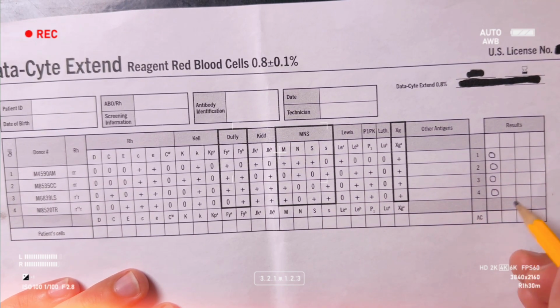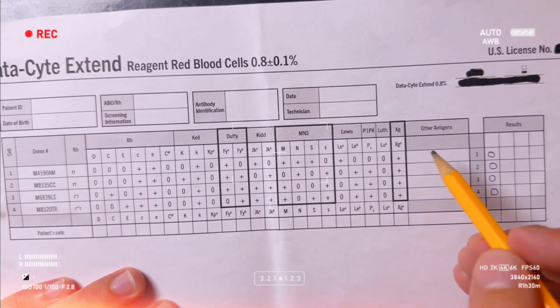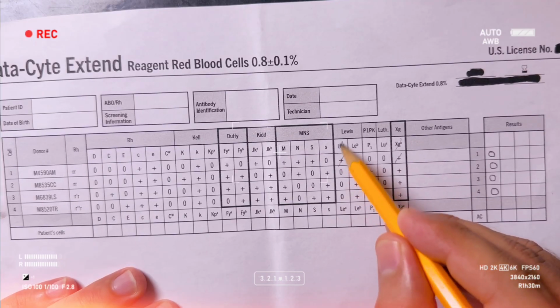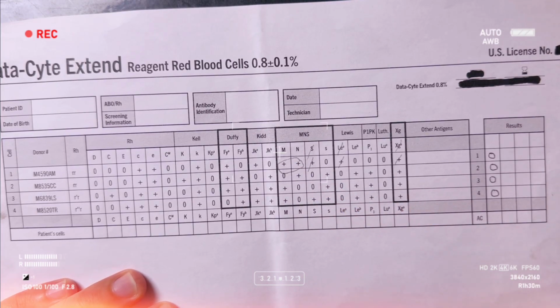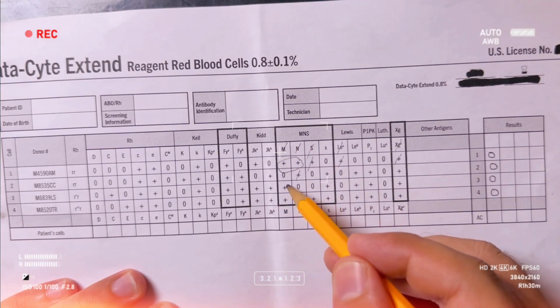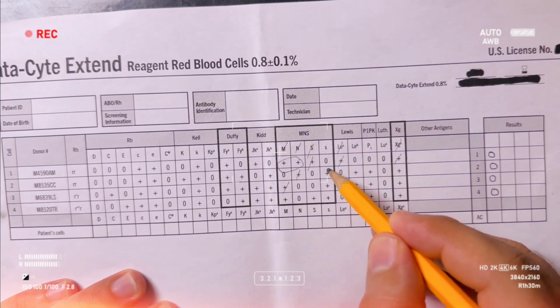So this is the extended panel reaction, all of them are 0, so I'm pretty sure that I will be able to rule out everything here. So this is one heterozygous. But I can use homozygous to rule out the M because all of them are 0, so I can use any reaction here.